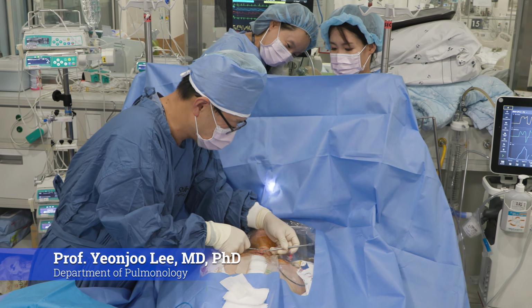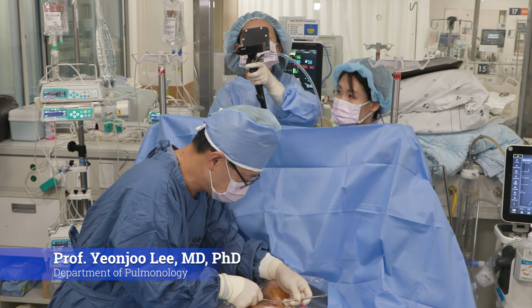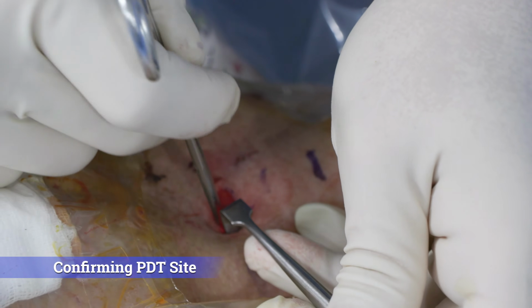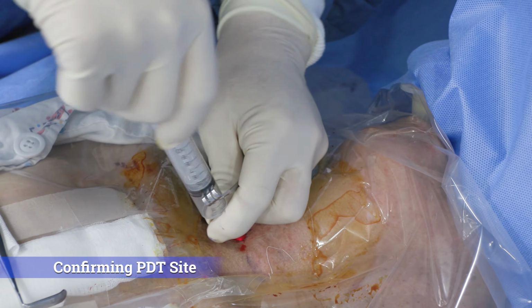Then the bronchoscope is inserted, and when the light from the bronchoscope becomes visible through the trachea, external pressure is applied to confirm the correct location. Next, a fine needle is used to puncture the trachea, and the position is reconfirmed.